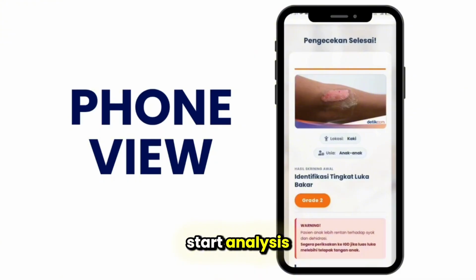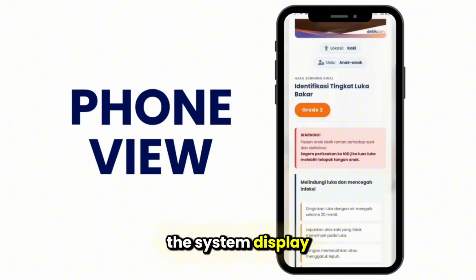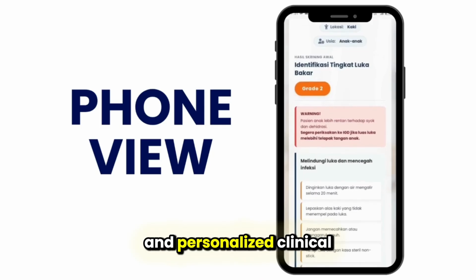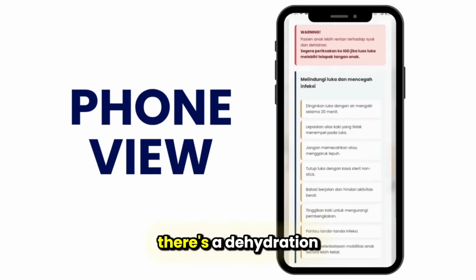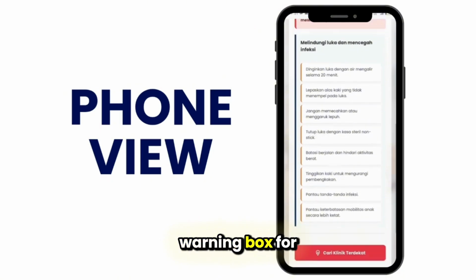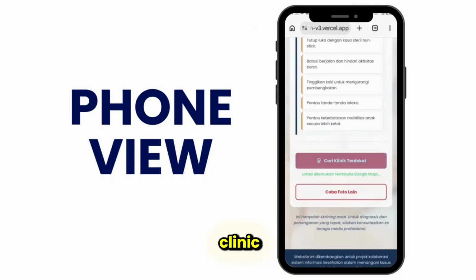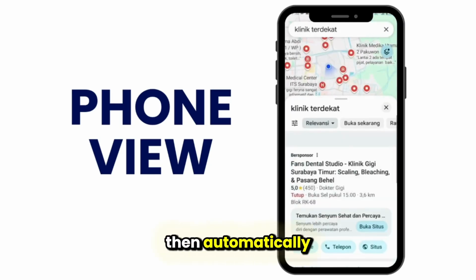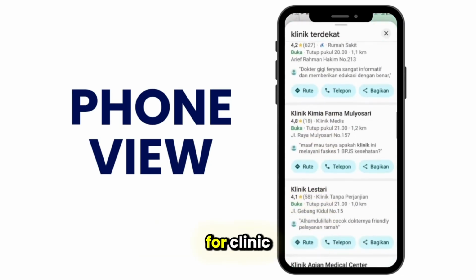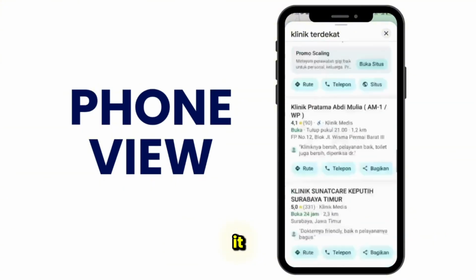When you click Start Analysis, the AI gets to work. The system displays a grade classification and personalized clinical recommendation. For example, there's a dehydration warning box for children. If the condition is severe, click Find Nearest Clinic. Your browser will ask for location permission, then automatically open Google Maps to search for a clinic based on your GPS location. Pretty handy, isn't it?